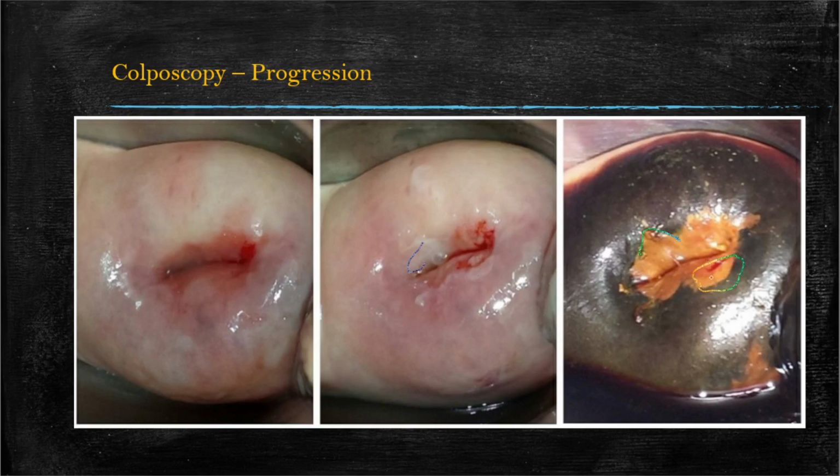So I would come in here and take a biopsy kind of in this area. I would probably come up here as well, based more on the aceto-white change. And then depending on how this looked, if that was just a little bit of friability or vascularity, I don't really see specific aceto-white changes there. There's this little bit of an area out there, so you could come out and take another biopsy in that spot.